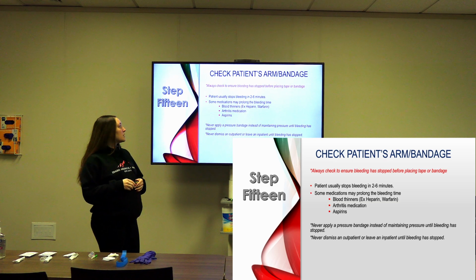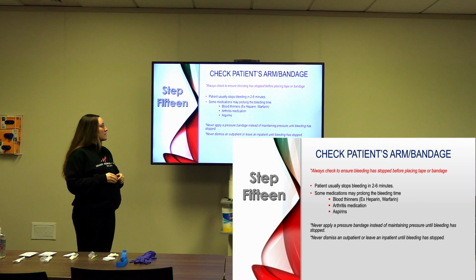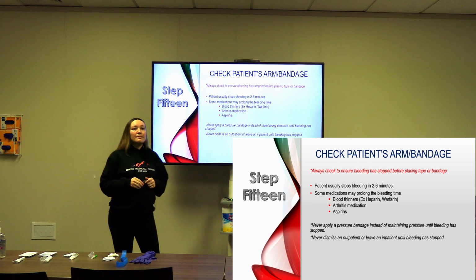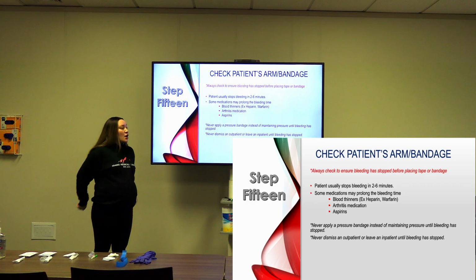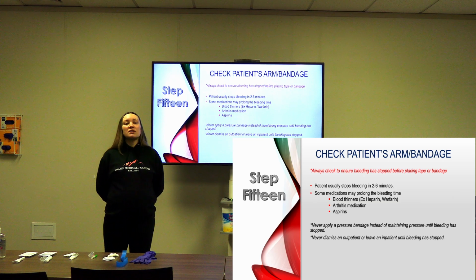Some medications may prolong the bleeding time: blood thinners, arthritis medication, aspirins, things like that. Never apply a pressure bandage instead of maintaining pressure until the bleeding has stopped fully. If we apply a pressure bandage and the patient is still really actively bleeding, it's not going to do anything. The patient's just going to continue to bleed under that pressure bandage because it's not adequate enough. Also, in an outpatient setting, never dismiss an outpatient until they've stopped bleeding.